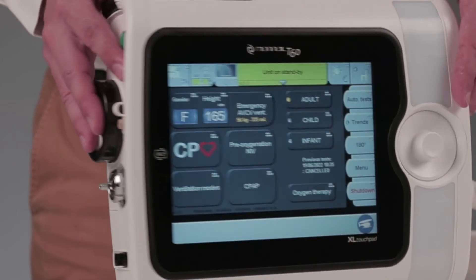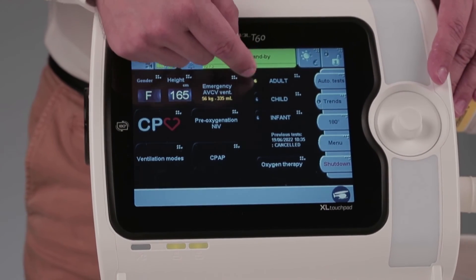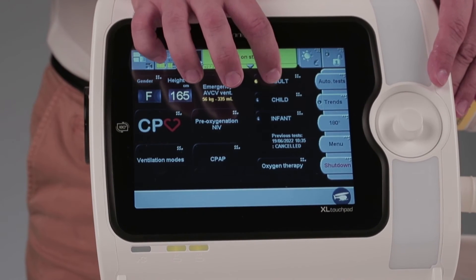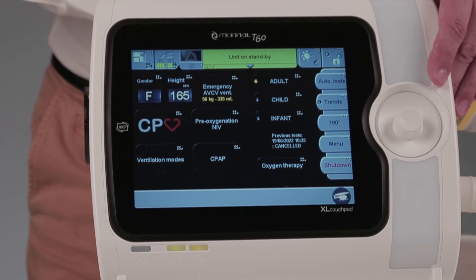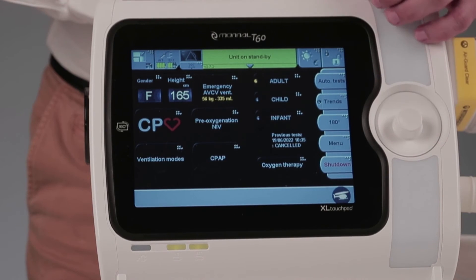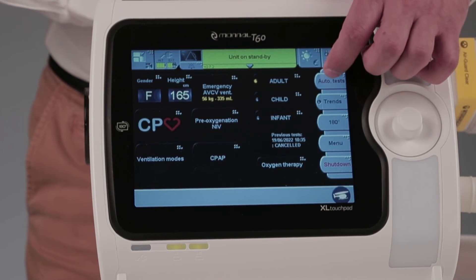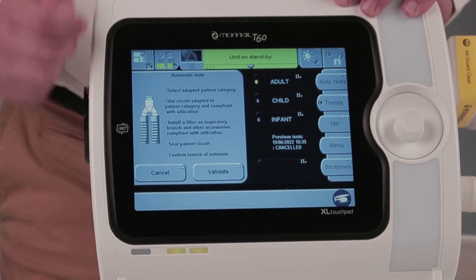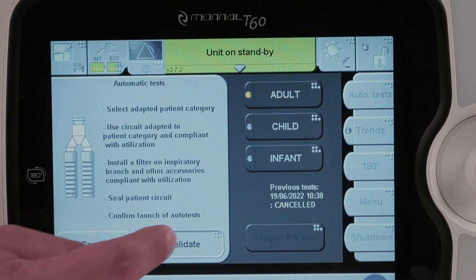Start the ventilator by pressing the on-off button. You can see three patient categories on the start screen. Let's select the adult category corresponding to the configuration setup. The autotest key is located in the upper right corner of the screen. The summary of the steps is displayed in the information window. Press validate to start the autotests.